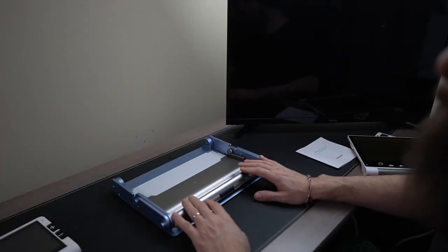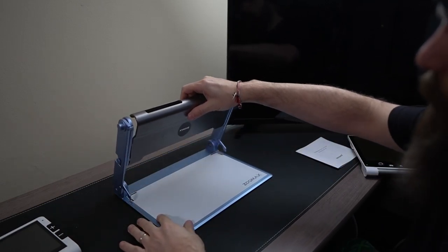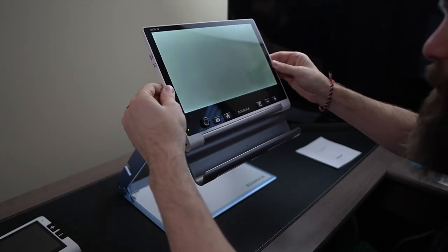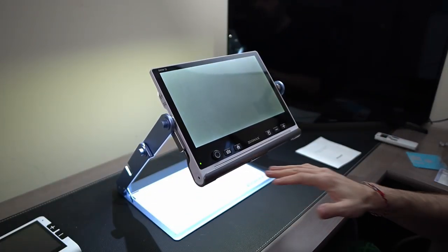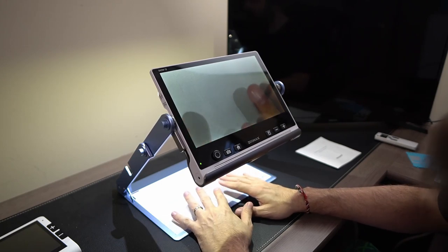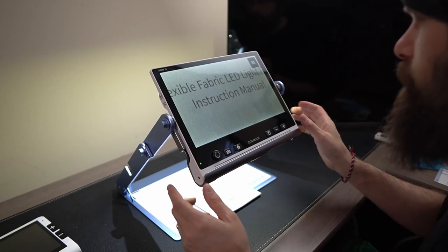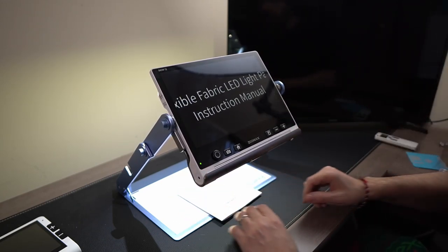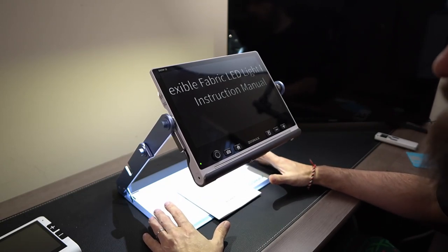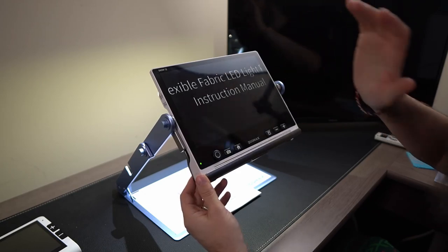The last thing I want to show you is the stand for the Snow 12. It's a nice compact design — all metal, probably aluminum. I can lift it up, this part rotates around, and I simply place the Snow into the stand. It automatically recognizes that it's in the stand, and now we have a fully functional desktop CCTV setup. So I can put my paper under here, use my controls, tap to focus, change different color contrasts, fill out paperwork, do a crossword puzzle, read a newspaper, or OCR an entire sheet of paper using this stand.